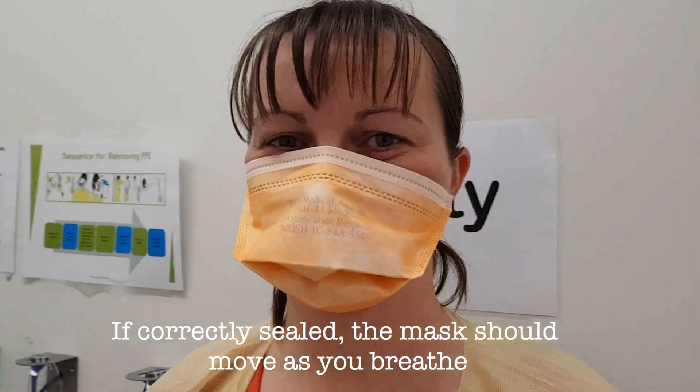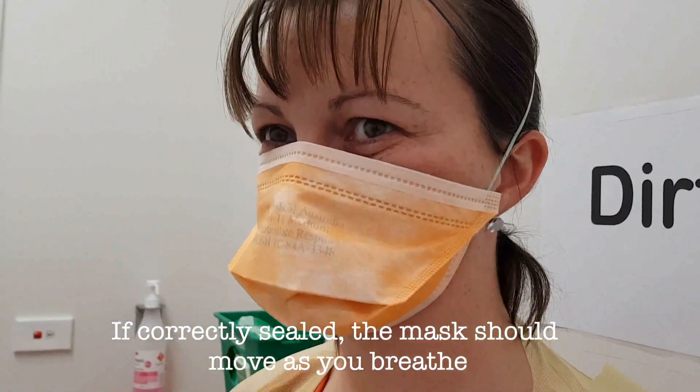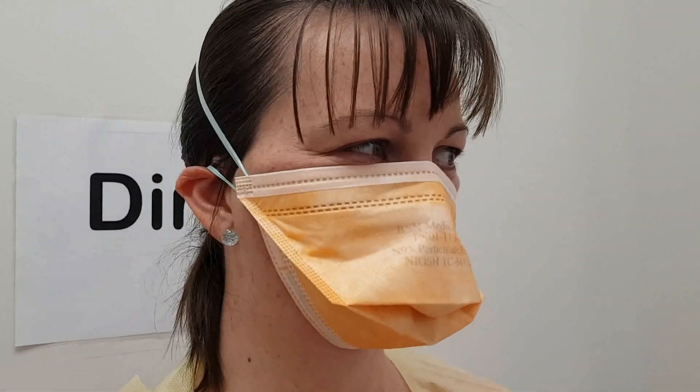Once you've got a seal and the mask well shaped to your face, you should be able to see movement of the mask as you breathe in and out. If it's not well sealed, you need to readjust it.